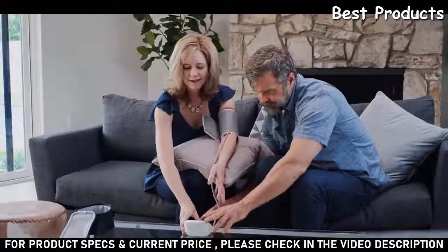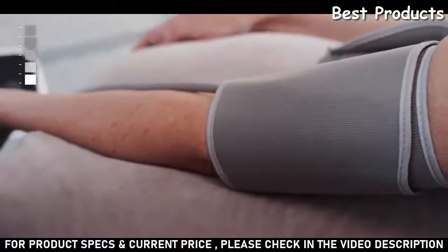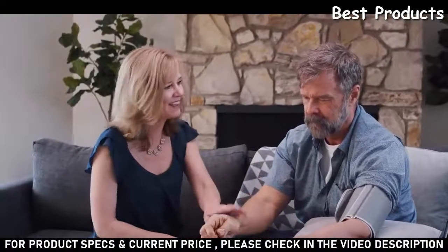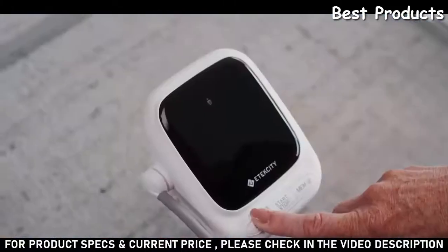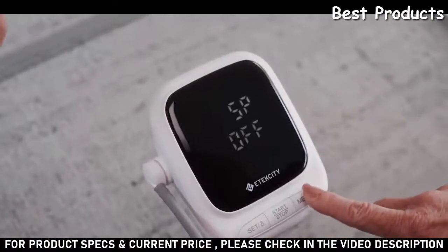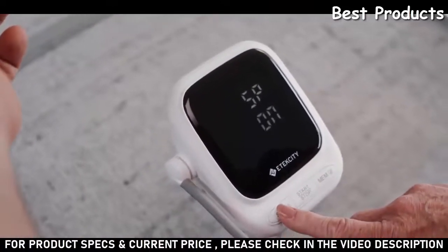The EBP UA5 features an irregular heartbeat indicator and a World Health Organization indicator to help classify your blood pressure. You can also take advantage of the speaker function to hear your blood pressure results read out loud. Press and hold the Set User button until the display reads that the speaker is turned off, then press the Memory button to turn the speaker on. Press the Set User button to confirm your choice.